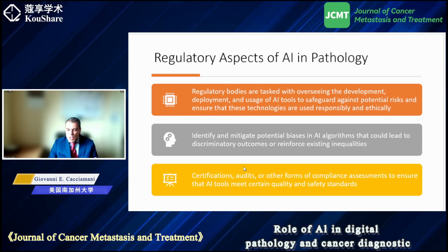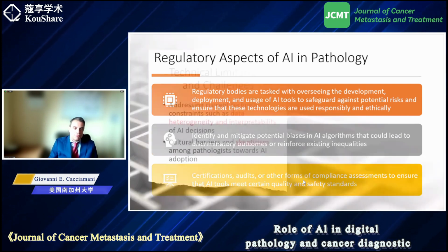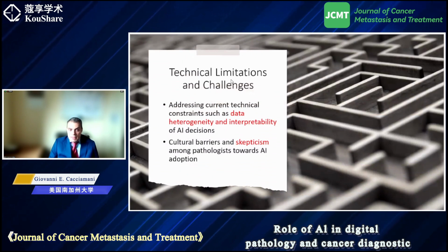Of course, this is a technology, and we can assume it will be a technology with very frequent updates and improvements of the system. So of course, we cannot just switch to a more advanced system without any check and test. There are technical limitations.